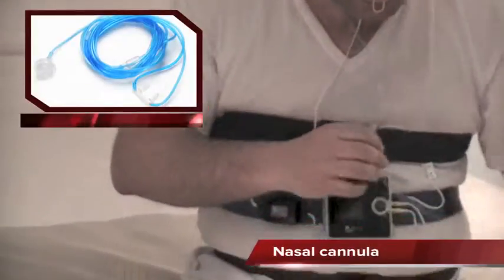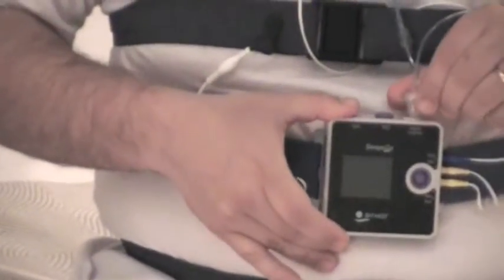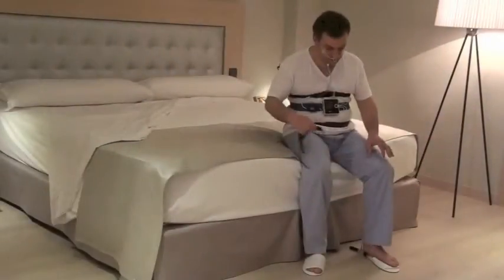Connect the cannula to the base of the connector of the device and turn it until the connection is secure. Finally, adjust the cannula under the chin. Hold the cables on the cheeks with the surgical tape. The nasal cannula will allow control of the respiratory flow and snore. The thermocouple sensor will allow us to control your respiration through the nose and mouth.